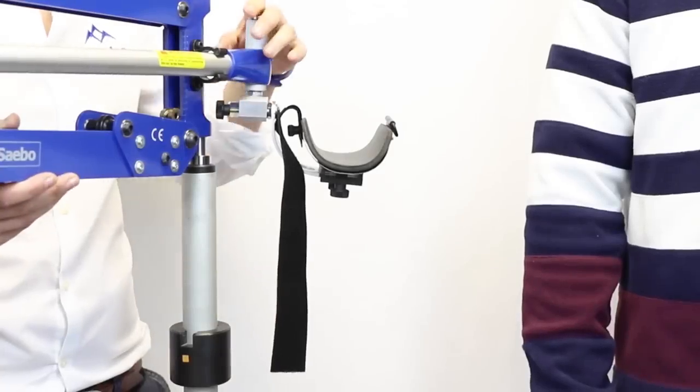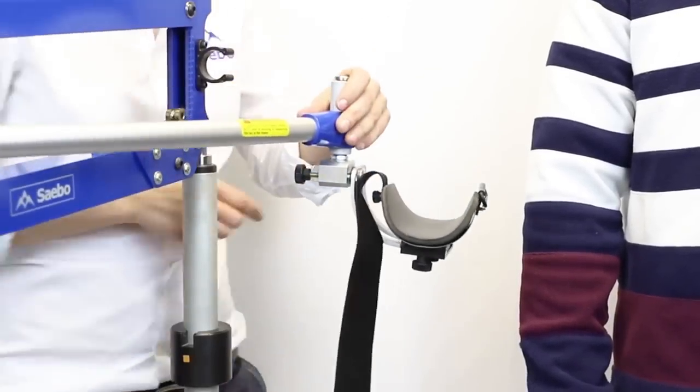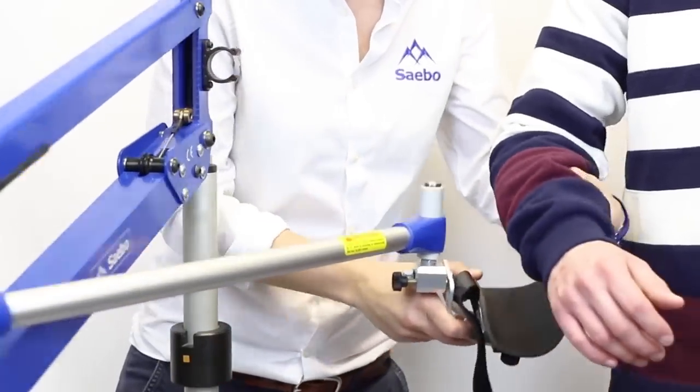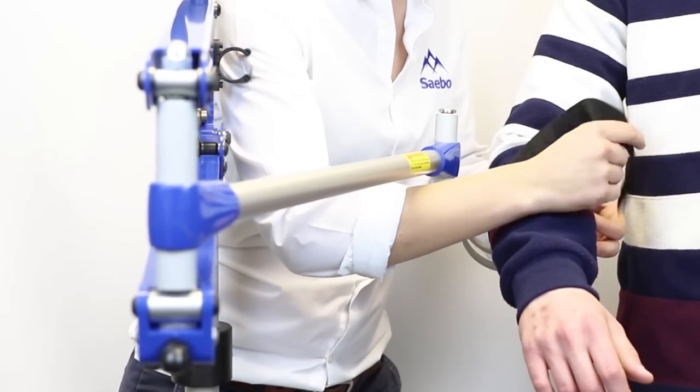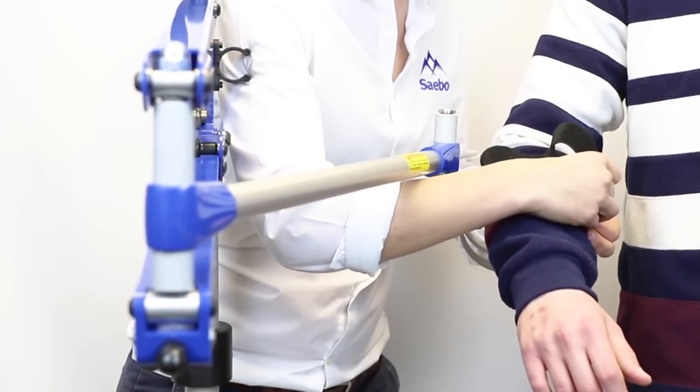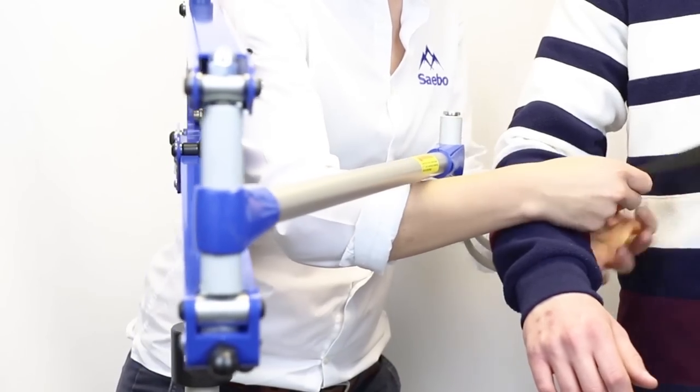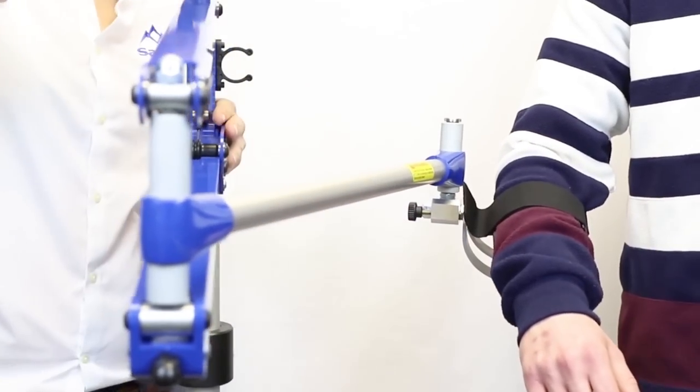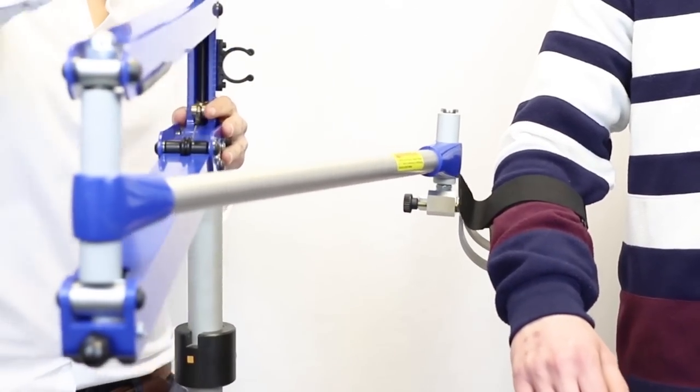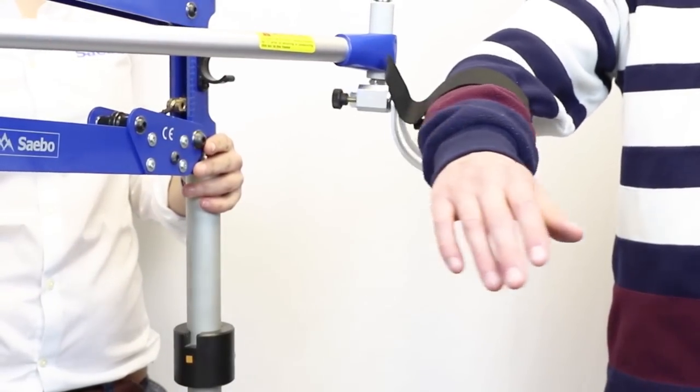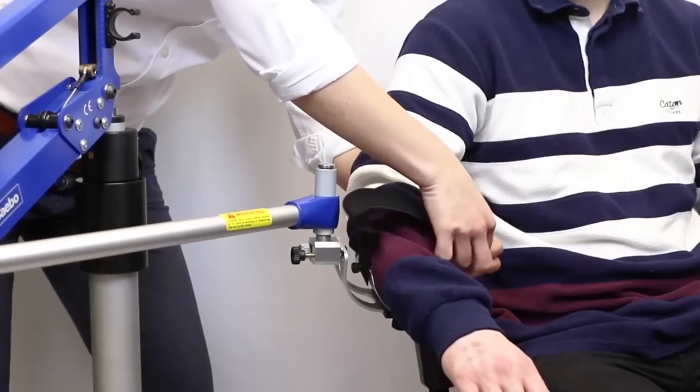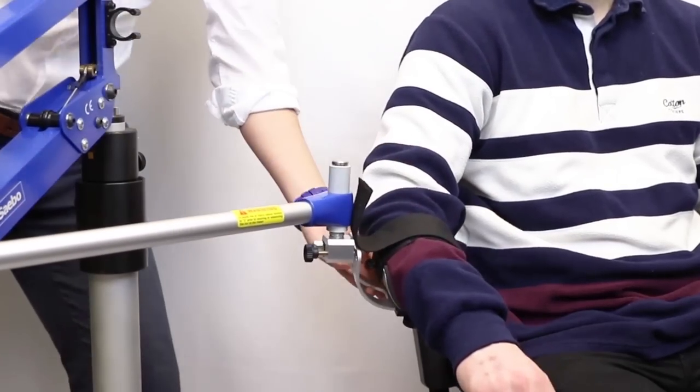You can use the Sabo Mobile Arm support in varying positions for your patient. You can use it in a standing position by adjusting the height. You can use it in a seated position.